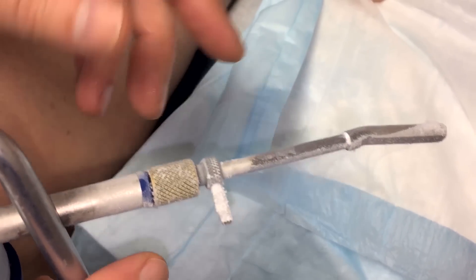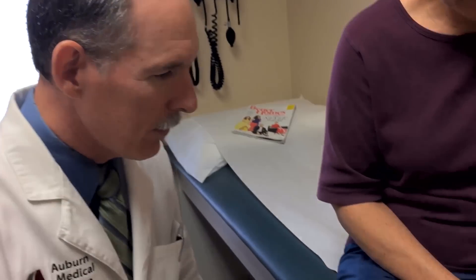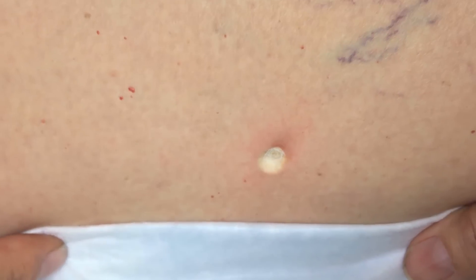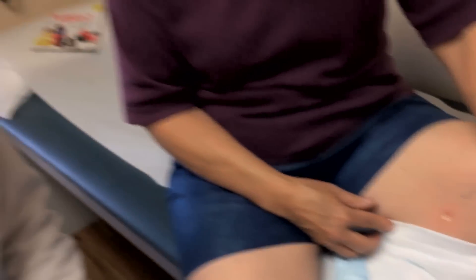That's just the moisture from the air — condensation. Hey, thanks for joining us. Thank you again, Joellen, for sharing your wart treatment with us. As it thaws, that'll continue to thaw and you'll get a blister there again. When that blisters up, make sure that it stays covered while it's moist, put some Aquaphor on it, and it'll take weeks for it to flake off like the previous one.